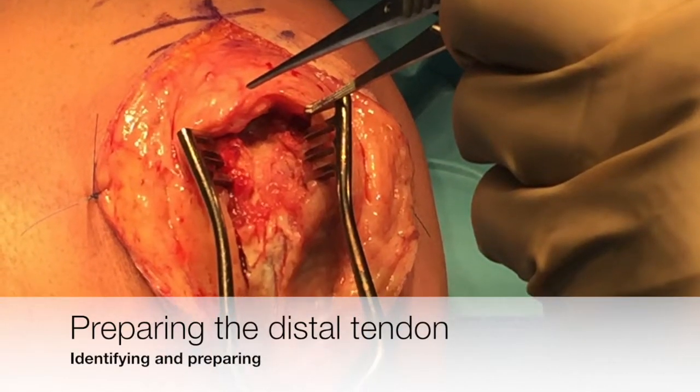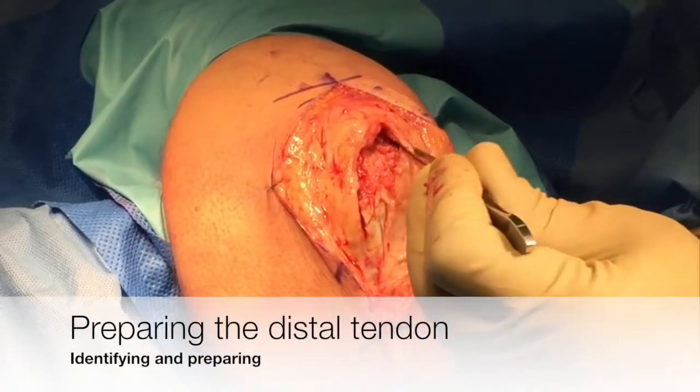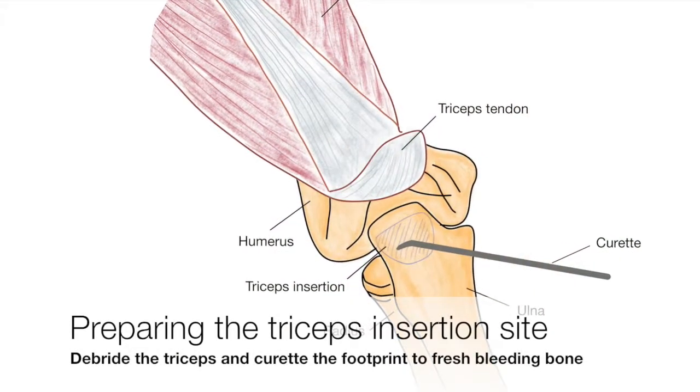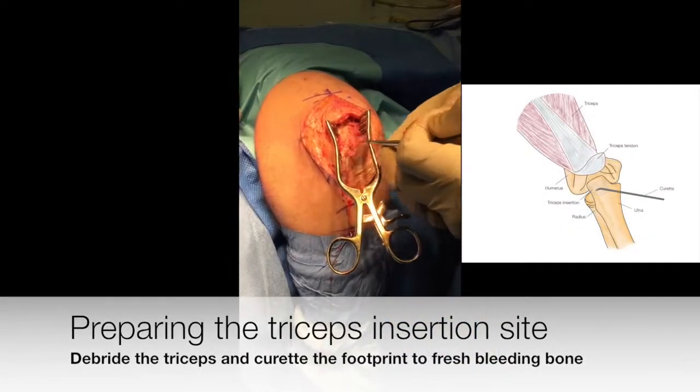The ruptured end of the triceps is identified, debrided, and mobilised. The triceps insertion footprint is then prepared and debrided to bleeding bone to optimise healing.